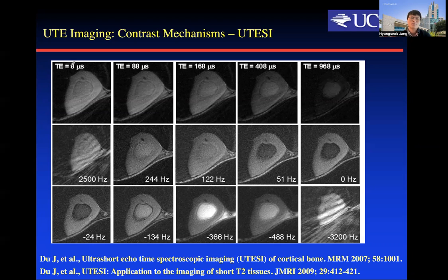So what you can do is put this whole 100 images into one giant matrix, and then in each pixel we can do the Fourier transform. Then you can get the frequency component in each pixel, right? Just like you do in spectroscopy. And as you can see in the higher frequency domain, there's only some artifact remaining because we did undersampling, right?